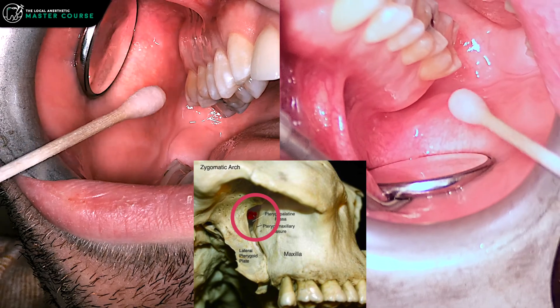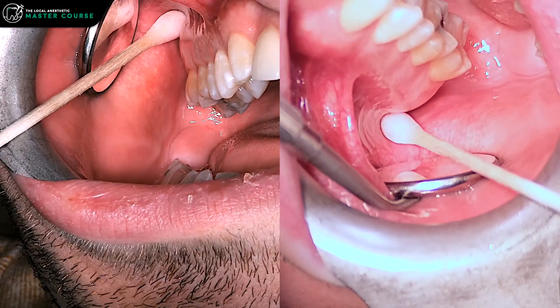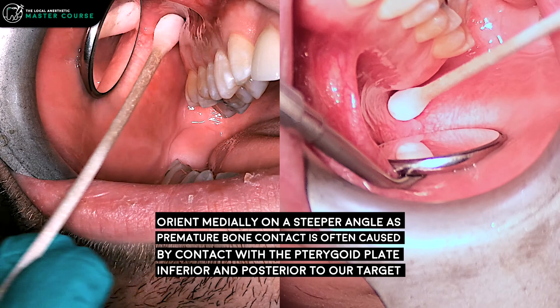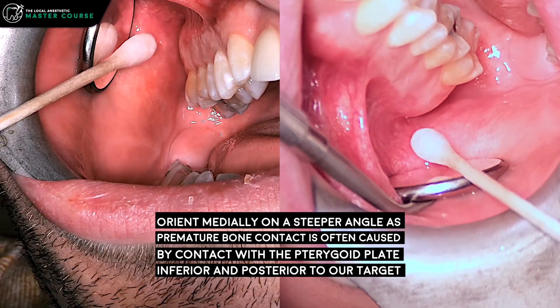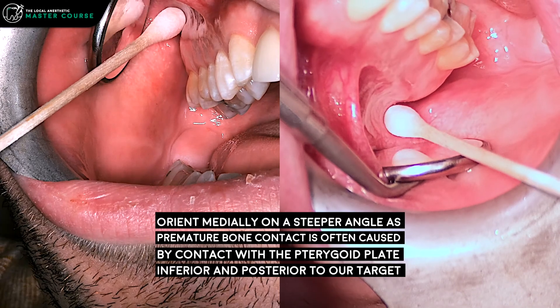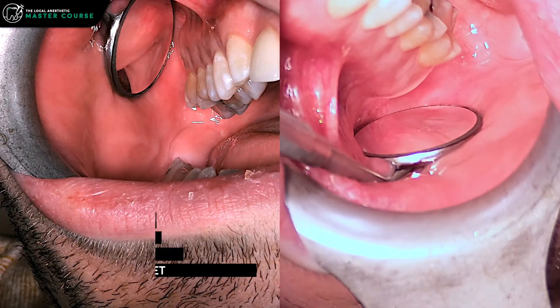As discussed in the tabletop demo video, if you're hitting bone prematurely and you're not at the required depth, you'll need to reorient your needle. Withdraw first — don't reorient while you're in the tissues. Then reorient, and typically you may want to go a little more medially to reach the depth you need.